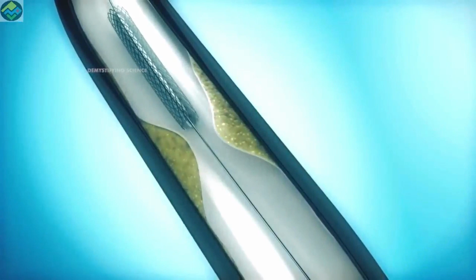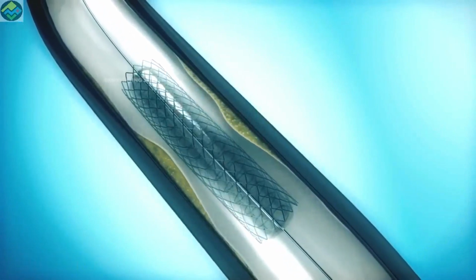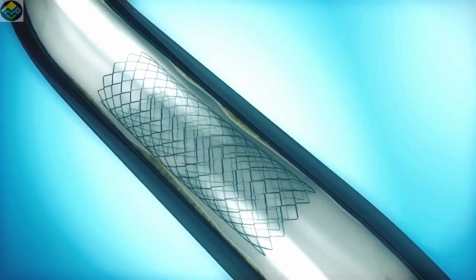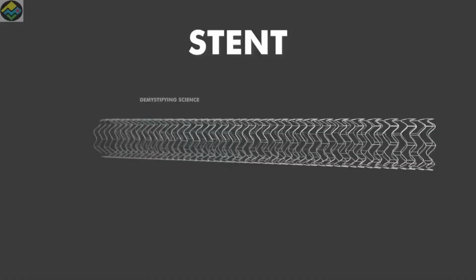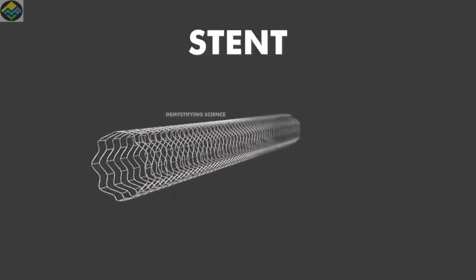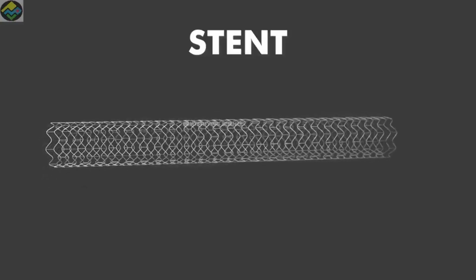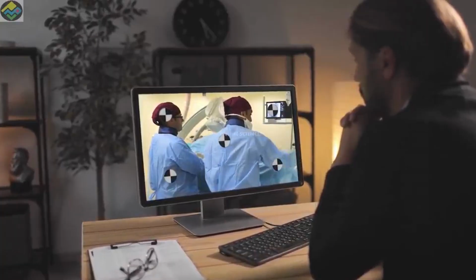In some cases, the catheter is also equipped with a stainless steel mesh called a stent. Most people who have an angioplasty also have a stent placed in their blocked artery during the same procedure. A stent, which looks like a tiny coil of wire mesh, supports the wall of your artery and helps prevent it from re-narrowing after the angioplasty. Here is what happens during a stent placement.